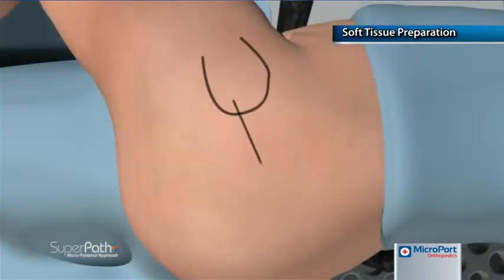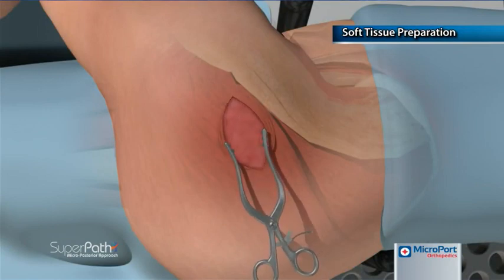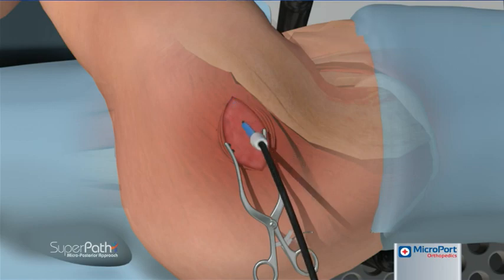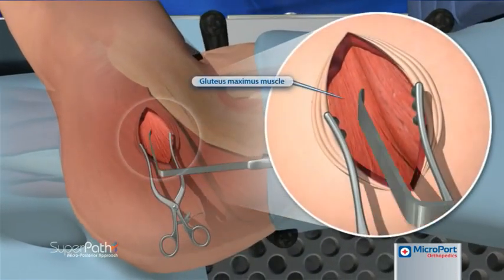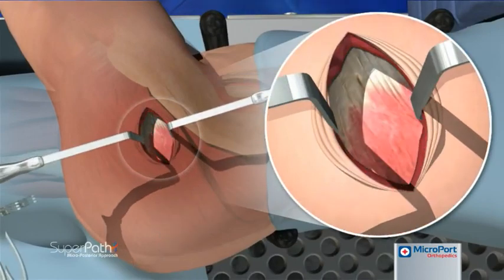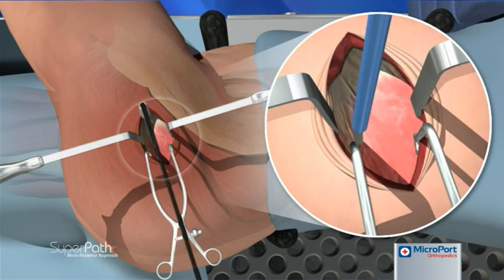The incision is initiated at the posterior corner of the tip of the greater trochanter and extends 6 to 8 cm proximal in line with the femoral axis. The incision is carried down to the fascia overlying the gluteus maximus, which is then incised using electrocautery in line with the main incision. A pair of wingtipped elevators may be used to longitudinally separate the muscle fibers with minimal trauma.